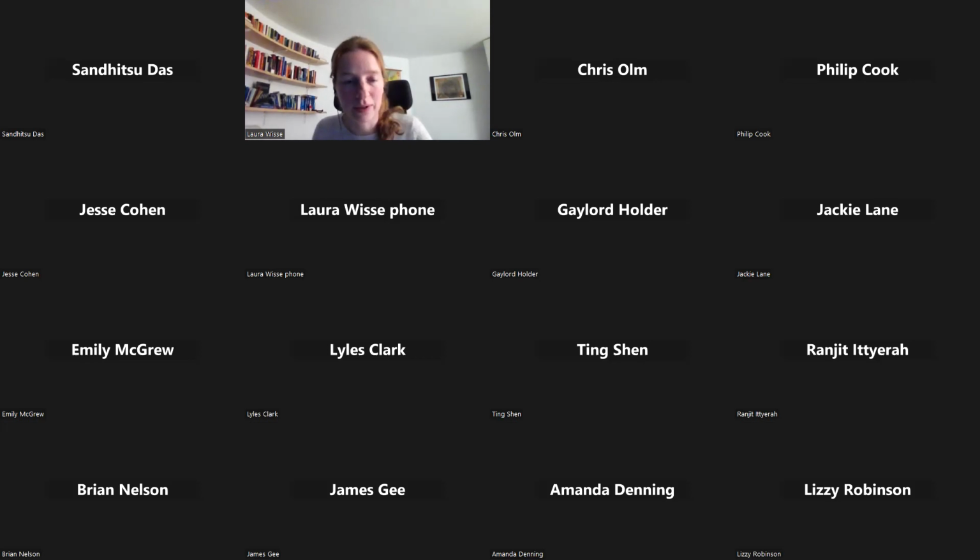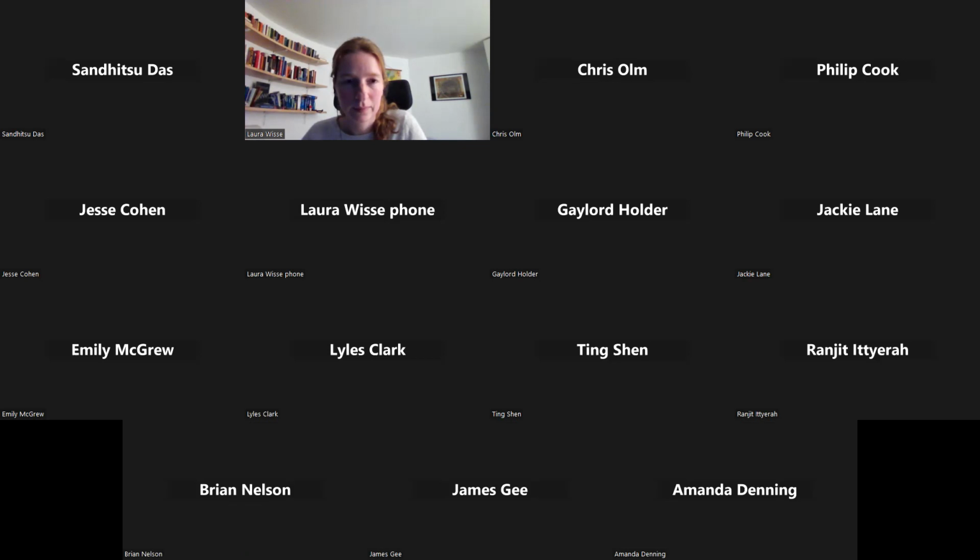So Laura, one thing I think it might be helpful to comment about is the different MRI sequences vis-a-vis the choice of atlas. If you had any guidance on that, for example, the 2 millimeter thick sequence versus the ABC 1.2 millimeter thick sequence. And I'll just start off by saying one thing which not everybody might be aware about.